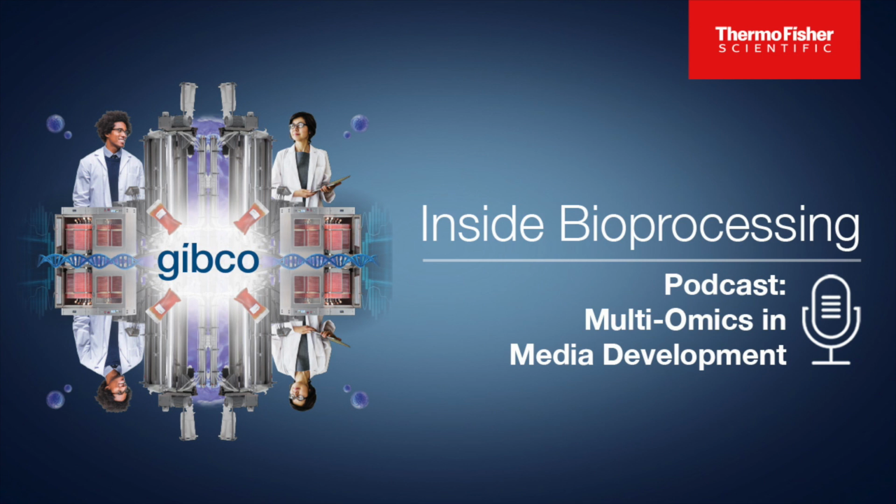And Femi, do you have anything else to add? I just want to emphasize what my colleagues have mentioned about using multi-omics for media development. You have the opportunity to really leverage intracellular information when you're making decisions about your process, versus using spent media analysis, which really uses only data from the media. So you're essentially working with a lot more information to determine what's going on within your process, and it allows you to get to the optimal process much faster and better.